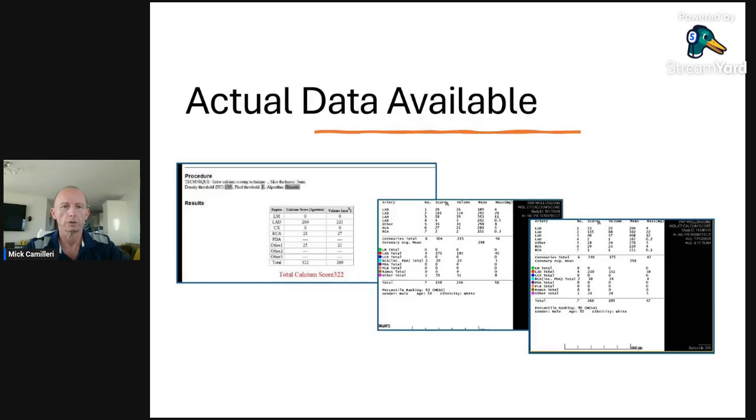The data that's available to the technician to make those assessments is a lot more detailed than what we would get in the doctor's report. So when you get a number, there's always more information behind it. The doctor would need to ask for that, or if you've got access to your scans, you can get in and do that yourself, which I do.